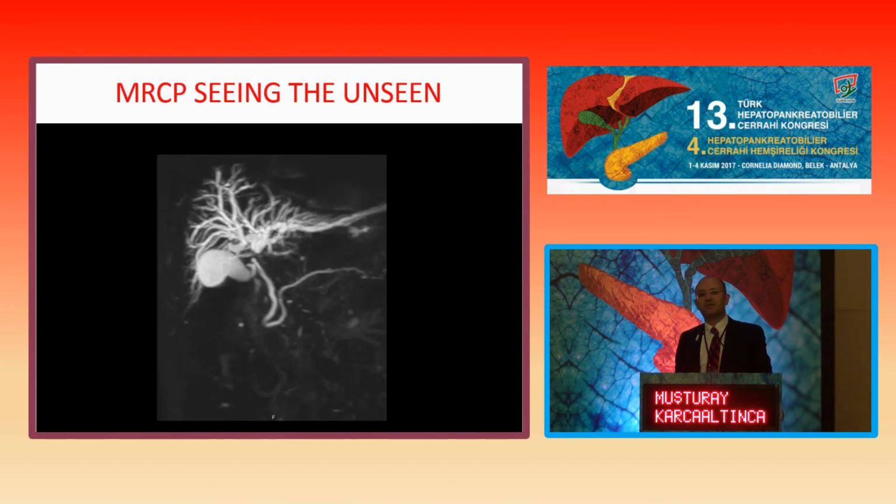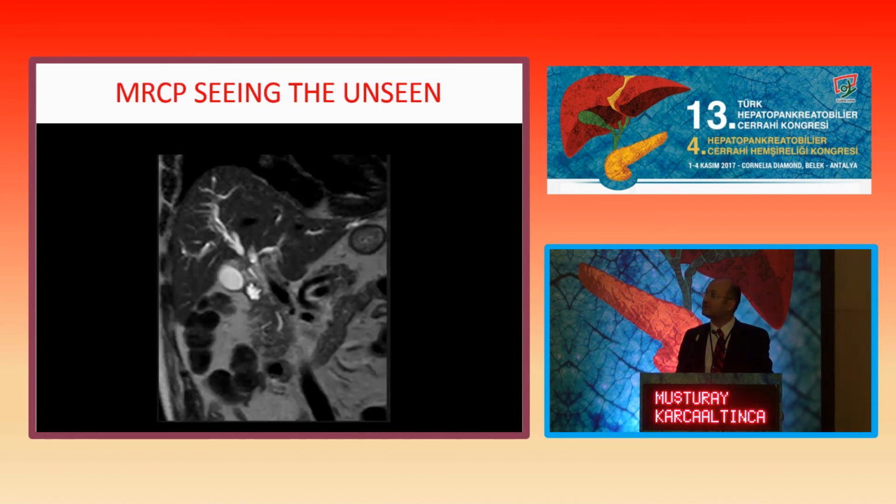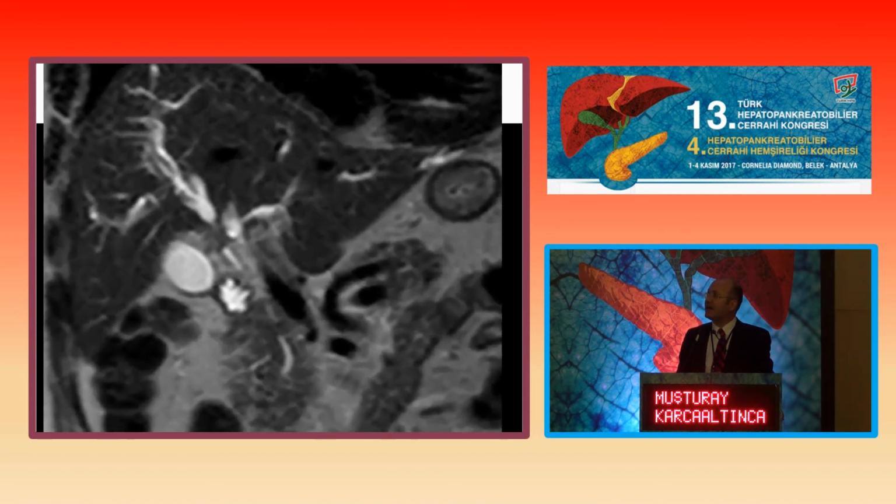This image is an MRCP image, and I'm going to focus the talk on MRI and MRCP. And this is usually what you get from ERCP. But the thing is, we're doing much better than this image because we can do thin images. You can see that there was a stricture at that point, and you can see that the stricture is actually a short stricture. And moreover, we can do cross-sectional imaging in addition to these ERCP-like images.